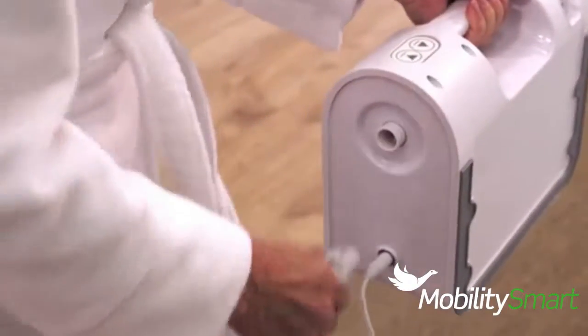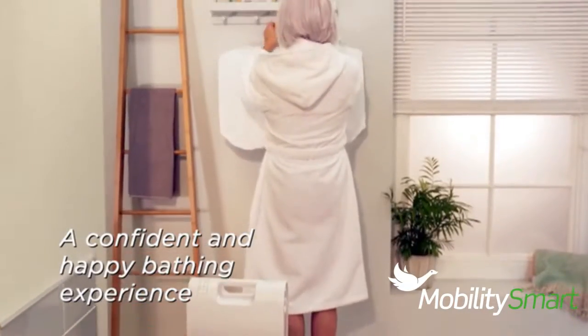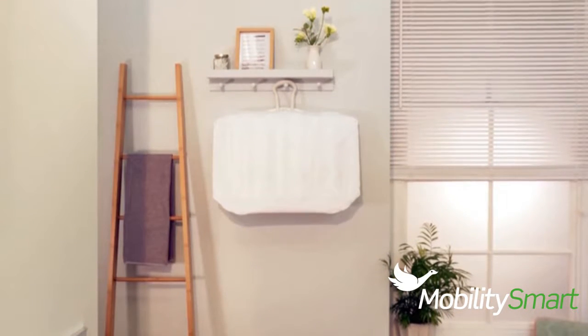Simply disconnect the hose from the compressor and let the bath lift deflate. The bath lift is as easy to pack away as it is to set up, so there are no issues for other bathroom users. You too can be confident and happy to bathe independently again.